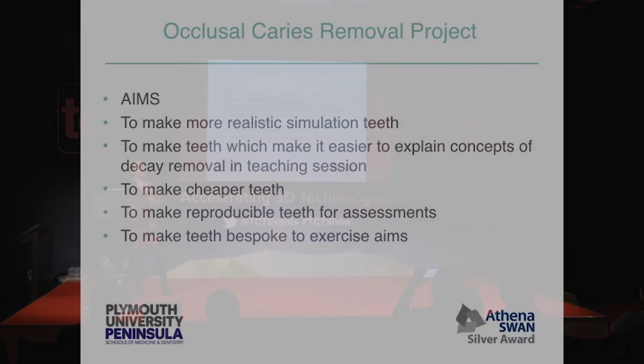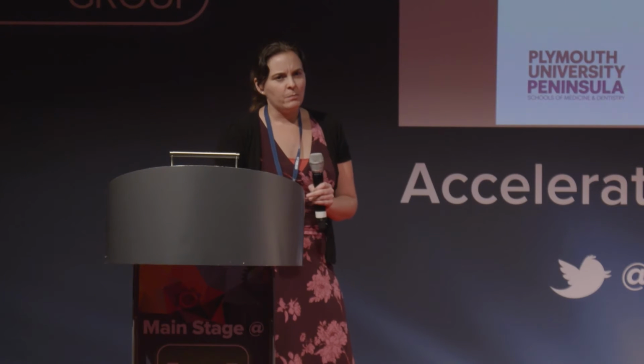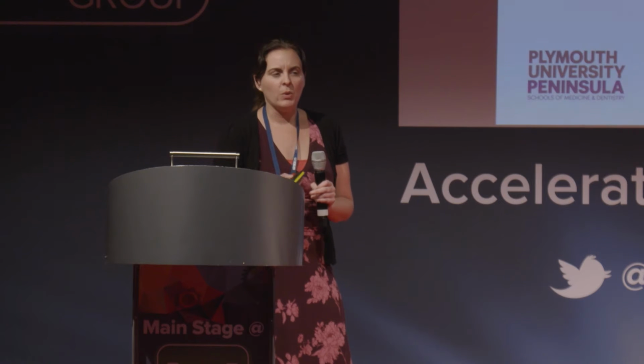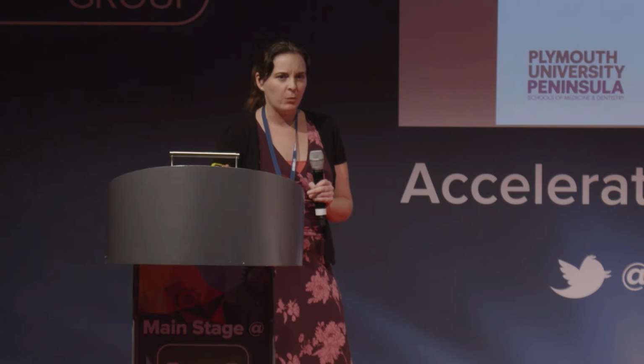So the aims of this project: we wanted to make more realistic simulation teeth. We want to make teeth which make it easier to explain the concepts of decay removal in the teaching session. We wanted to make maybe cheaper teeth. We want to make them reproducible for assessment so that everyone's sitting the same exam, which is fairer. And we want to make teeth that are bespoke to our exercise aims. At the moment we're buying mass-produced teeth and we're trying to adapt our teaching to fit them. And actually we want to make models that are made for us, not something off the shelf that we have to adapt.